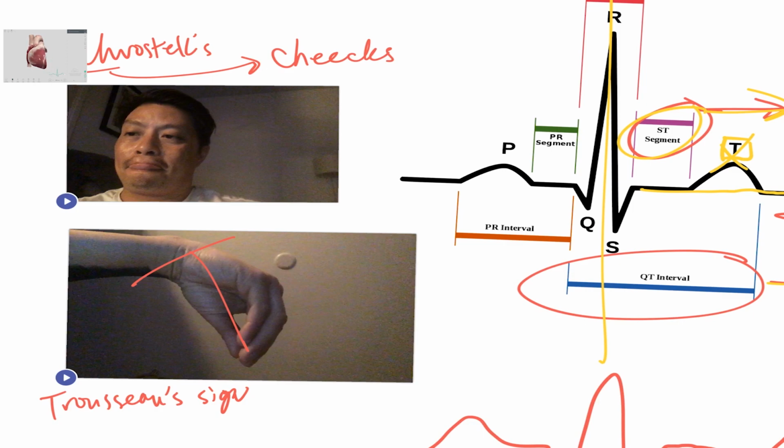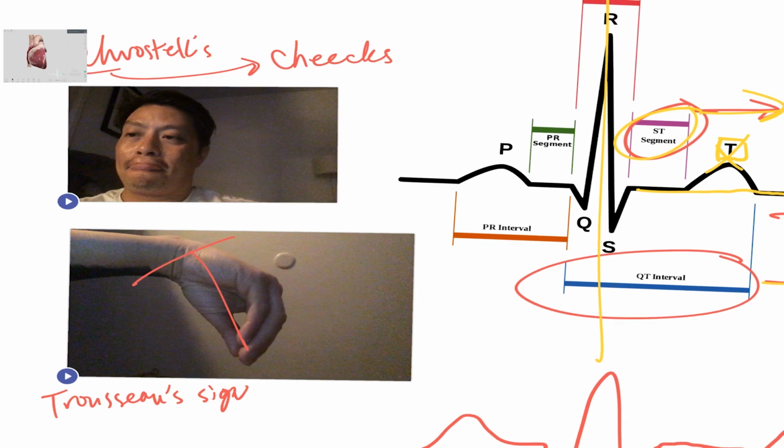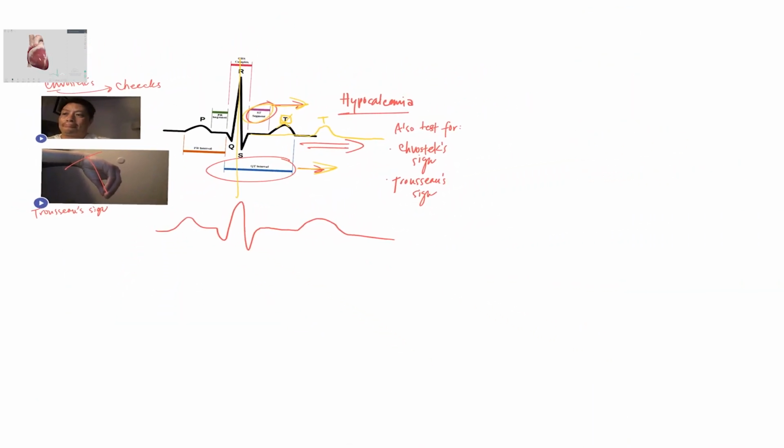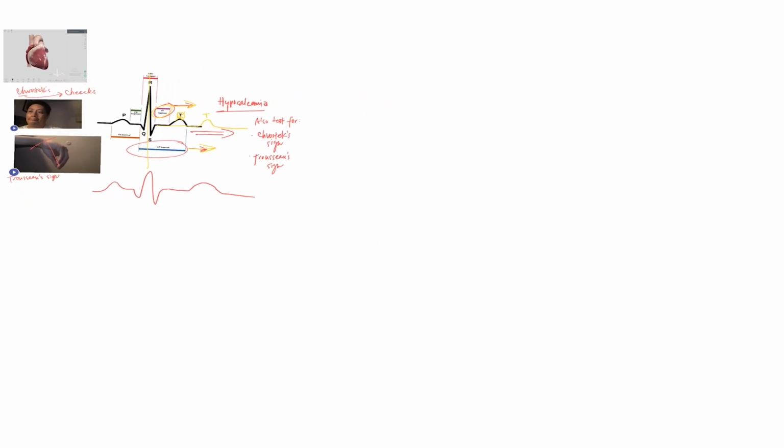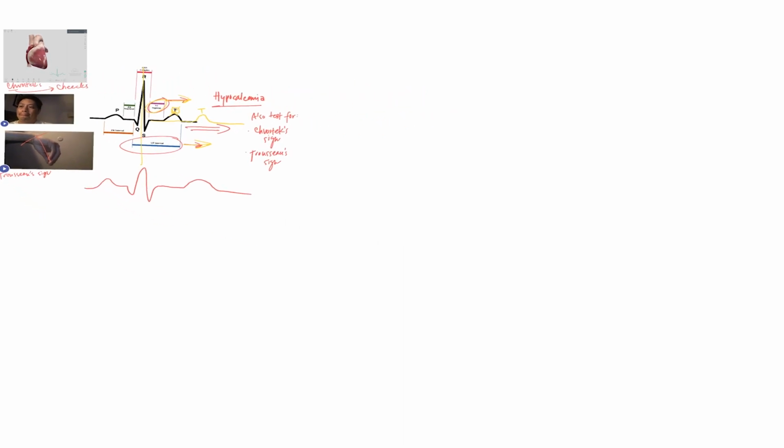All right, so there you have it. You have the different EKG changes for three main electrolytes that affect the heart and the EKG, and that's the EKG that you see and monitor when you're in the tele cardiac unit or the ICU. There are, of course, more electrolytes than that, but I just chose to focus on these three, whether it's hypo or hyper, because they're the ones that come to my mind the most.